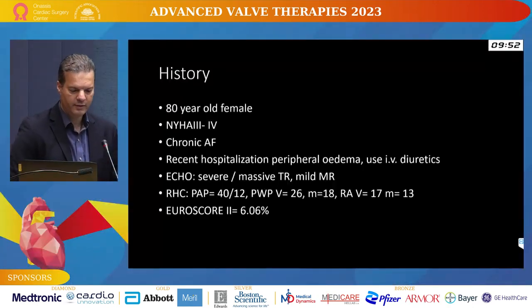Live in a box, TriClip case. So this is the history of the patient.